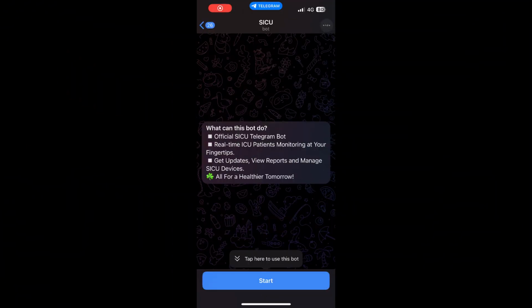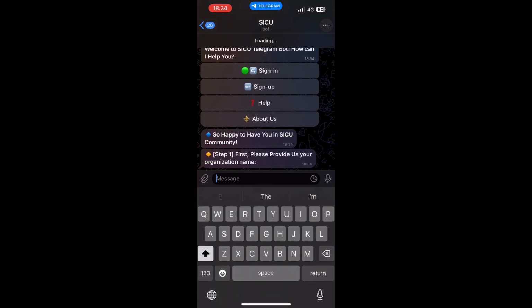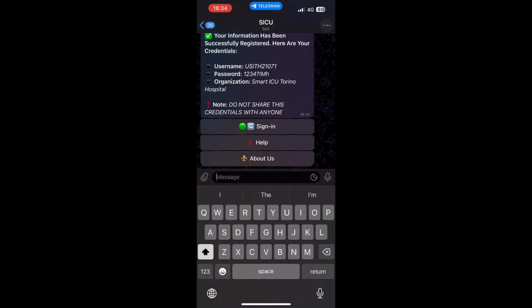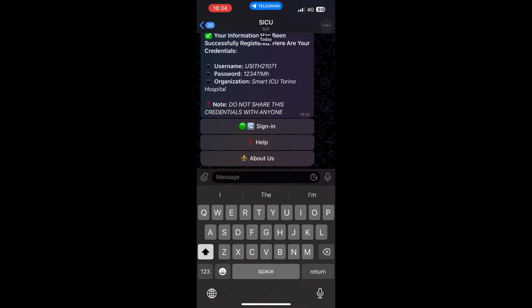This is our Telegram bot that can show warning messages and reports of analysis tools to the user. By pushing start, you can see a sign in and sign up box. First, you must register by entering the organization name and then an account password. This message is sent to the catalog, and the catalog gives you a unique username and password depending on the organization. Now you can sign in by entering this username and password.